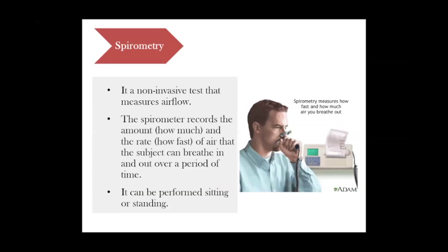What's spirometry? Spirometry is the gold standard test in all pulmonary function laboratories, and it's the first test that is requested from a physician in order to be able to diagnose their patients. It's a non-invasive test that measures airflow, and the spirometer records the amount and the rate of air that the subject can breathe in and out over a period of time. So it only measures the airway function. It can be performed either sitting or standing, depending on the patient category. For example, pregnant women or obese patients do the test while they are standing to avoid their abdomen restricting the diaphragm.